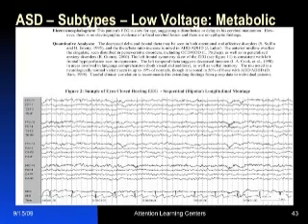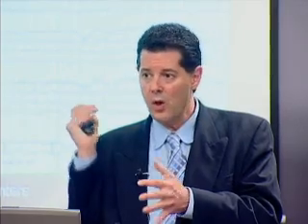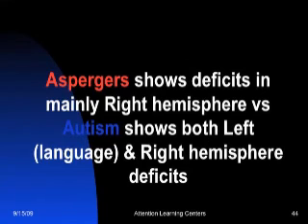And this is the low voltage, and it's kind of hard to see, but the brain waves are really, really small. So one of the important things to know about the QEEG, you need to look at it 2 ways. First, you have to have a neurologist look at the raw EEG, which is what this is. Neurologists are trained. There's at least 50 different types of abnormal EEG. There's no computer program that can do this better than the human eye to date. And then you have to look at the maps, like all the circles, to see the patterns of ADD and autism and Asperger's.